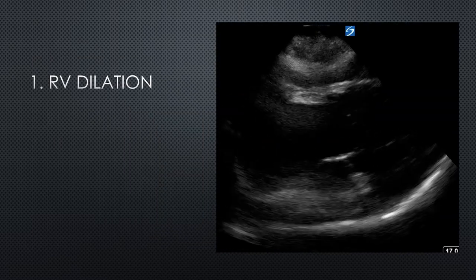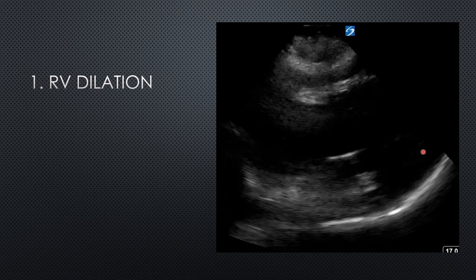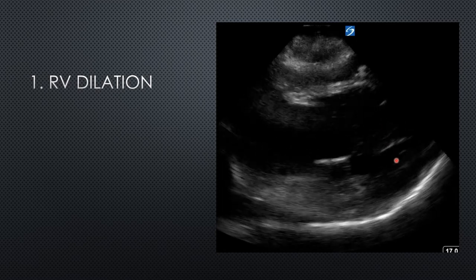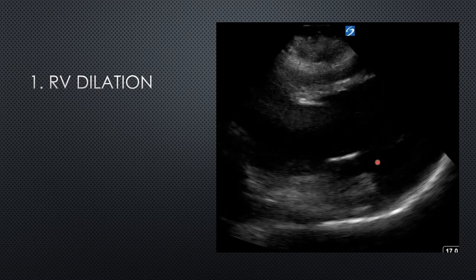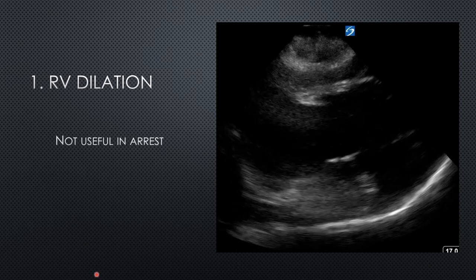This subcostal view was taken during a cardiac arrest in the rhythm pulse check. Here is the RV and here is the LV. Is the RV dilated? Yes, it's definitely bigger than the LV. But is that specific for a PE in the context of an arrest? No, it's not. Our guard did a study in Denmark where he took 30 pigs — 10 put into arrest through hypovolemia, 10 through hyperkalemia, and 10 through arrhythmia — and in all 30 pigs, the RV dilated within about 30 seconds of the arrest. So RV dilation is a common phenomenon in cardiac arrest and is not specific to PE.